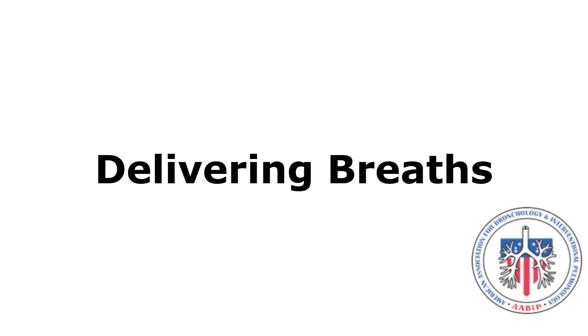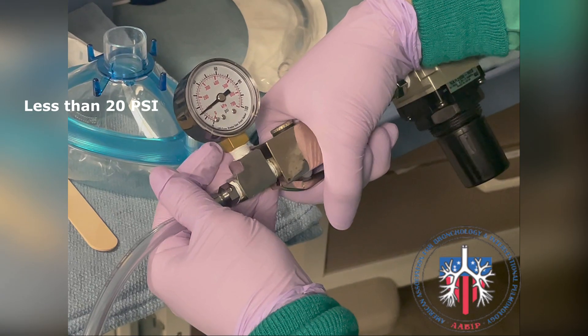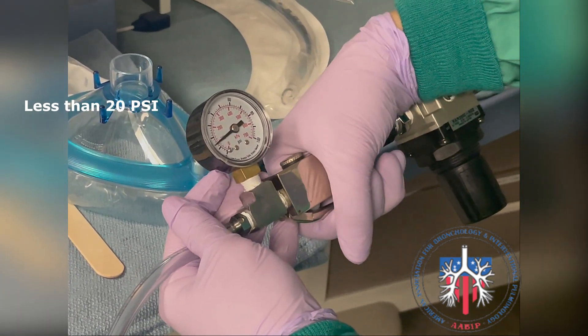Delivering breaths. Here is the jet ventilator regulator — here is the pressure gauge, the handle, and the connecting hose. To deliver a breath, the handle is depressed so a breath is delivered over approximately two seconds.